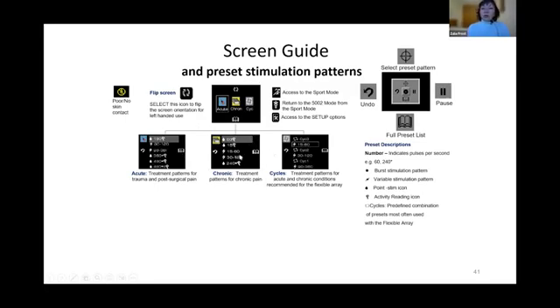Okay, so the presets you have 60, 15, and then you have two variables, 15-60, the lowest, 30-120. It's the same as here. So this is universal. If you're completely stuck and you forgot what I need to do, use this. When you move the device, use 30-120 and 240. Well, if it's skeletal muscular pain and it's very strong, use 240, okay? But if it's a neuropathic pain, you go for 15. We have the protocol for you there.